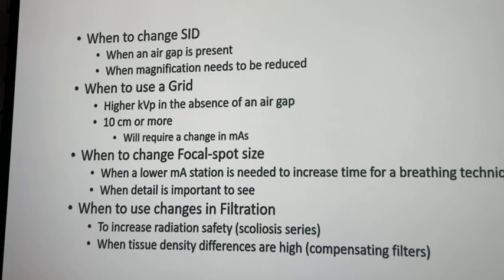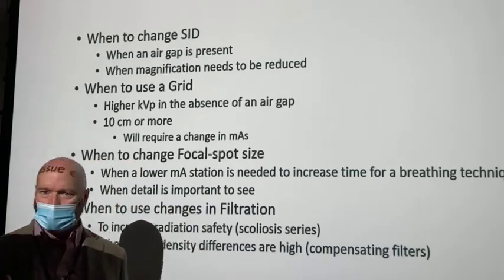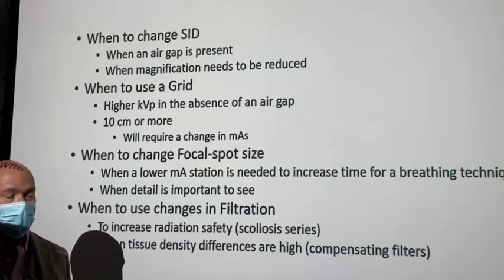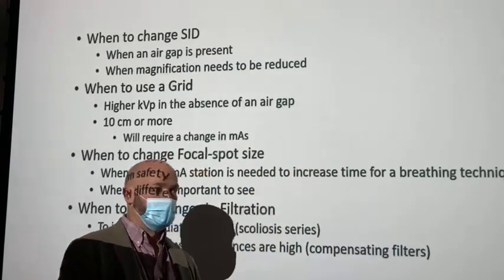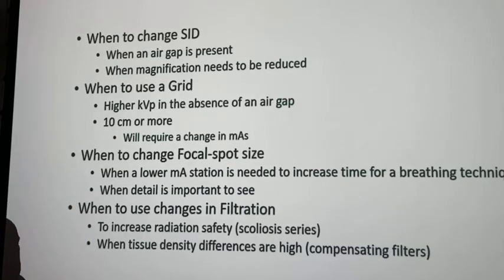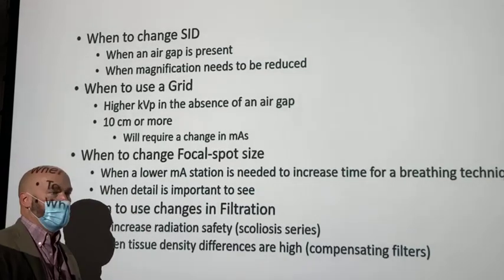When to change your SID? One is whenever we change our OID. If you increase your OID and you don't want the magnification, there are times we'll want the magnification, but if you don't want the magnification, you increase your SID. You increase your SID and it brings that down. Sometimes you need to increase your SID, not because of an increase in OID, but rather to reduce the magnification anyway.